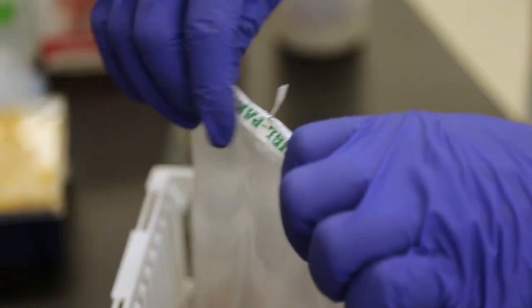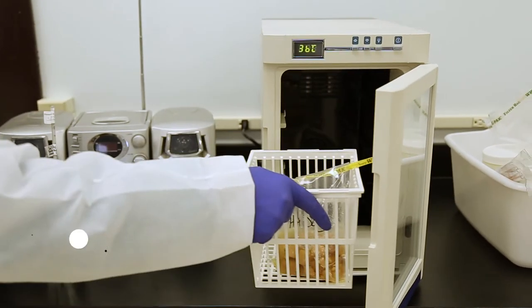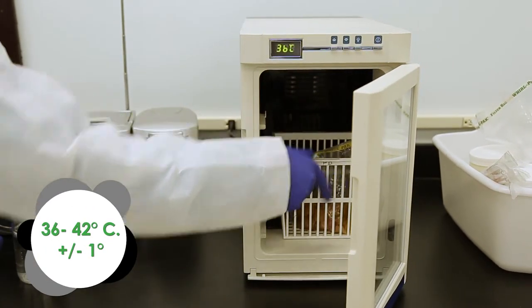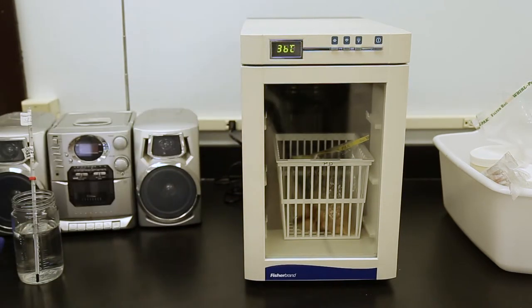Fold the stomacher bag several times, then fold the tabs in. Incubate at 36 to 42 degrees Celsius, plus or minus 1 degree, for the listed amount of time as found in the kit insert.